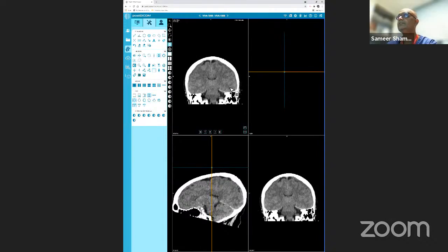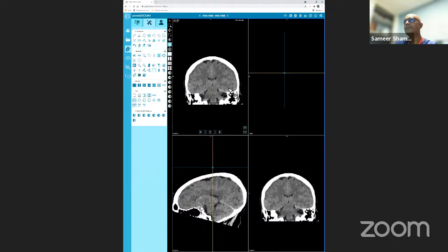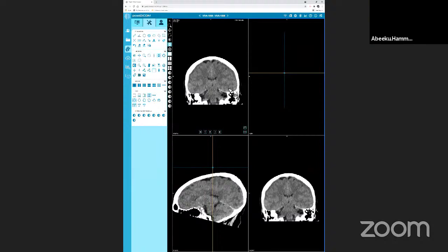That gives me a better idea of it. Okay, that's the coronal plane? Yeah, that's like a rabbit ear, isn't it? So there isn't any significant downward transtentorial herniation, but there is a pressure effect on the frontal lobes and effacement of the lateral ventricles. So there is a local pressure. I'll alert the referring physician with a view to neurosurgery involvement. Depending on the center, sometimes they do intracranial pressure monitoring. If it's high, they do craniectomy to relieve the pressure.